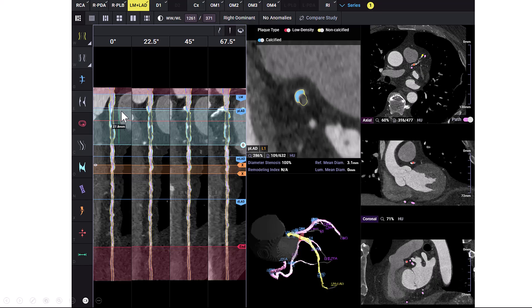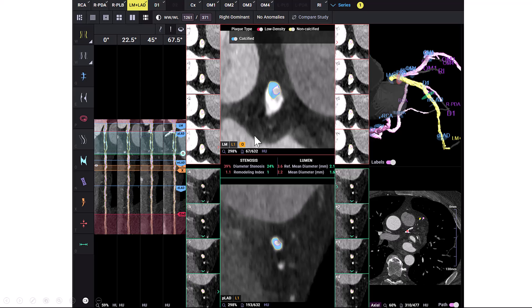We can use the measurement tool to measure the length of the occlusion, which measures at 27.8 millimeters. We can also use another feature of the same software to better understand the proximal and the distal cap. We do have significant calcification in the proximal cap as well as significant calcification of the distal cap.